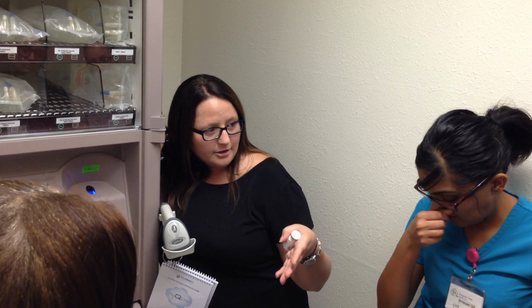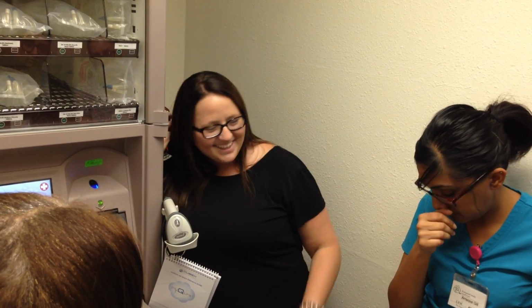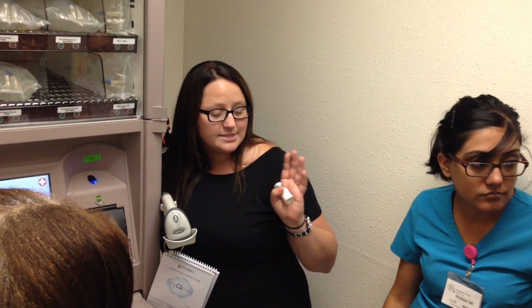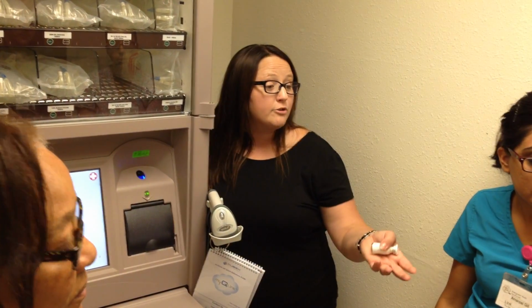I had a facility that got 3 tags because they pulled multiple doses of controls and they were sitting on the cart. They were being really nice because their friend was coming on after them and they were going to help them out by pulling from the CubeX for them. They did not administer the meds they pulled. If you are pulling, you should be administering it. So just keep that in mind. It's great to do nice things for your friends, but if it's not within regulation, just don't.